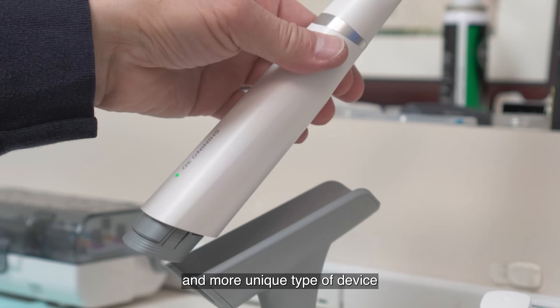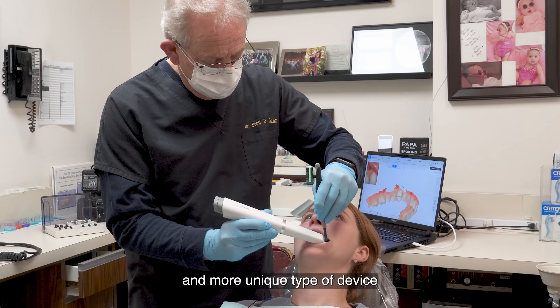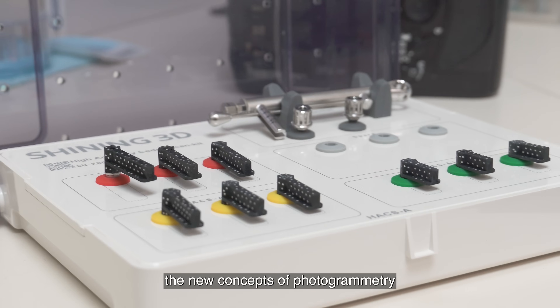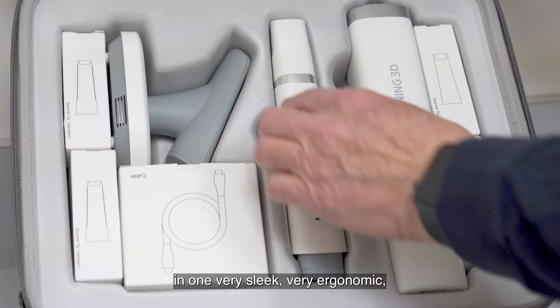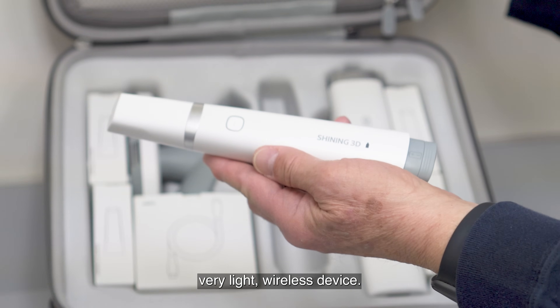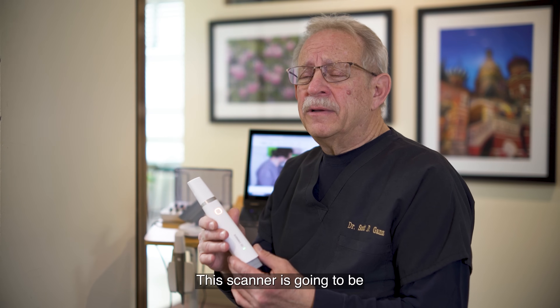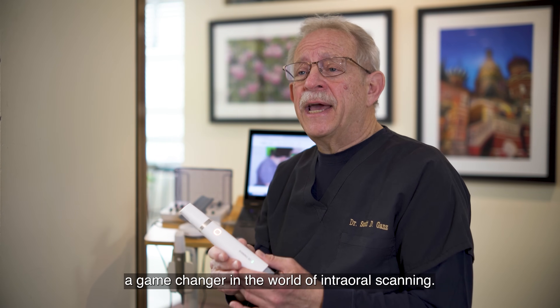I can't imagine a better and more unique type of device than one that combines intraoral scanning with the new concepts of photogrammetry — in one very sleek, very ergonomic, very light wireless device. This scanner is going to be a game-changer in the world of intraoral scanning.